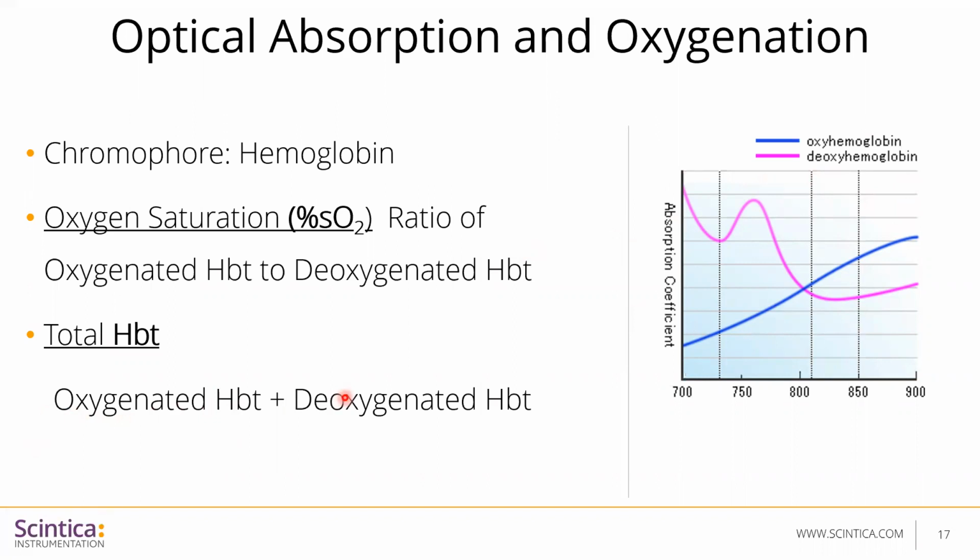And this is widely used in cancer research, where we can look at the oxygen level within the tumor or around the tumor. We can also look at whether these tumors are hypoxic and can predict the response of the tumors to various therapies, where hypoxia will be one of the negative prognostic markers.